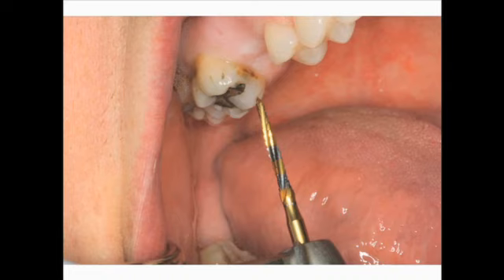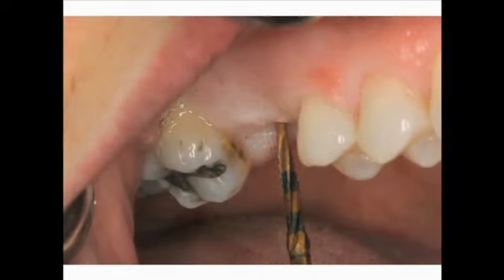This is a very sharp drill with a point, and it also cuts on the side, which allows lateral positioning or placement of the implant. The Lindemann guide penetrates the soft tissue and the bone and will go in about several millimeters so that we can determine angulation.